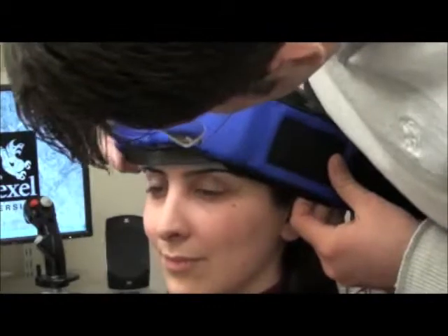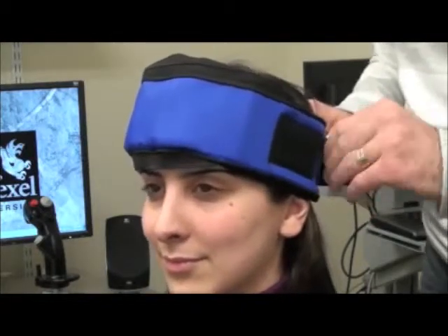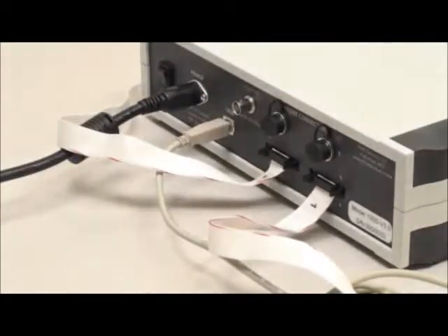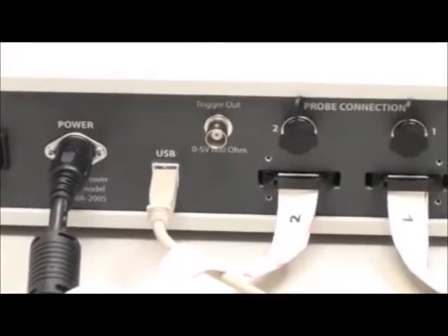Sometimes a headband, elastic and/or firm cloth, such as a tennis band or bandana, can be placed over the FNIR sensor to secure coupling of the optodes with the skin. After the sensor is positioned, signals at all channels should be verified by starting data acquisition. First, the sensor pad should be connected to the FNIR hardware control box. The device should be connected to the computer by a USB cable, and both systems should be powered on.